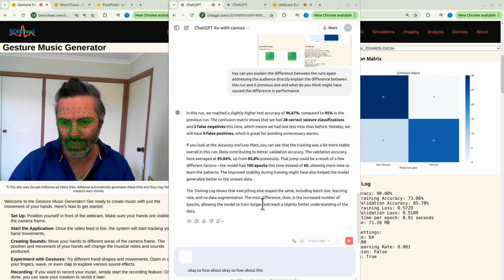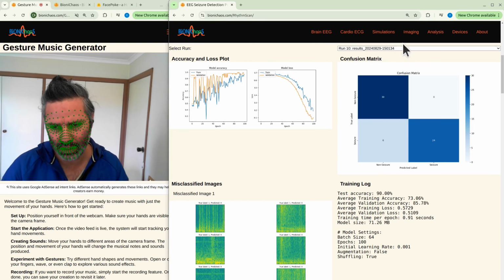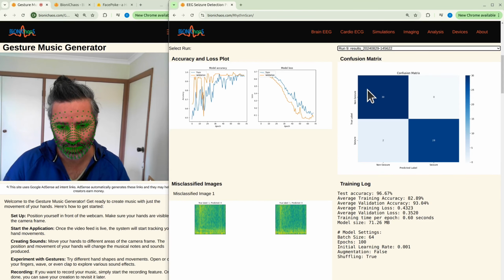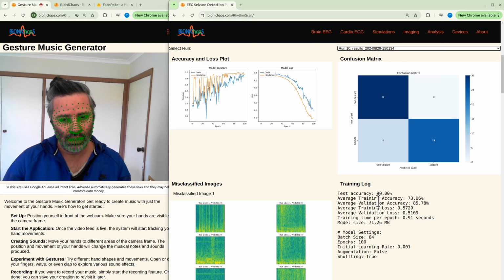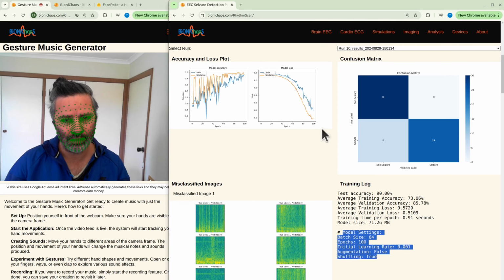Okay, so how about this last 10th run? Why did the performance drop all of a sudden? I don't quite understand why there would be such a significant drop in test accuracy, especially with the same model settings. It's almost a 7% reduction in test accuracy. Is it still within the noise? As in, if I run this training 100 times, what would the error for the test accuracy be? Assuming the model settings are the same every time, what do you think that will be?